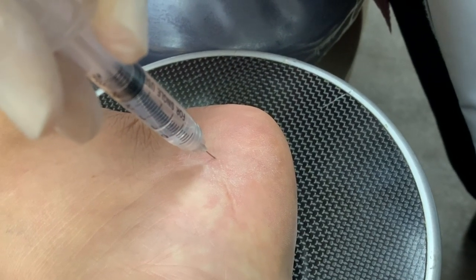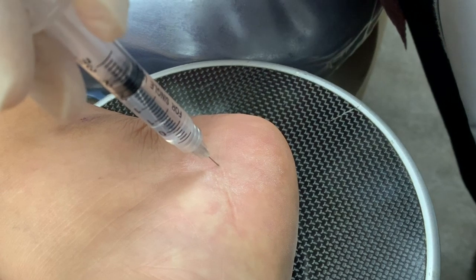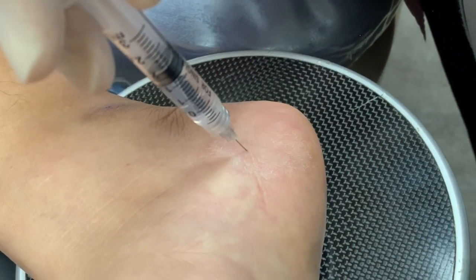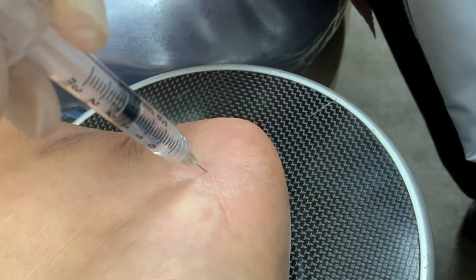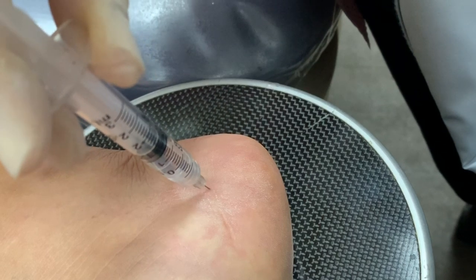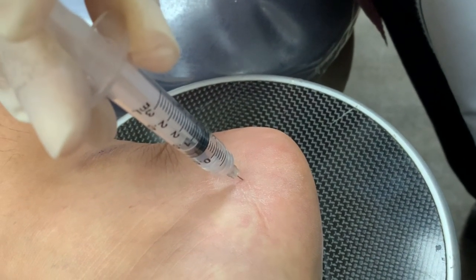How do you feel Dennis? Any pain at all? I don't feel anything at all. Good. Something else I do differently is that I numb this area really well so that the patient doesn't feel any pain when the needle is in and out of that area, because I want to inject all around the area of the insertion of the tendon into the heel bone.